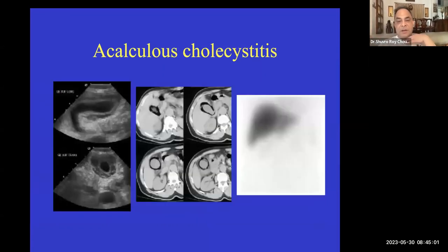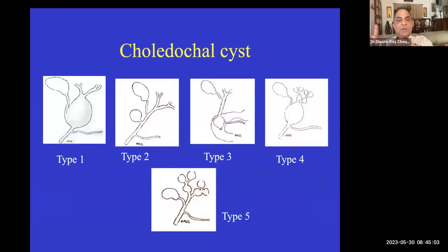Let me see if I've got. So very quickly, choledochal cyst, very important. Before that, Dr. Bhowmik has asked a relevant question. Often, patient having a biliary leak, after ultrasound, surgeon jumps to doing an MRCP. But most of the time, we find that if there is a significant collection in the gallbladder fossa, an MRCP is not helpful. What's your opinion? When do you do MRCP, if you suspect biliary duct injury in the immediate post-op period?